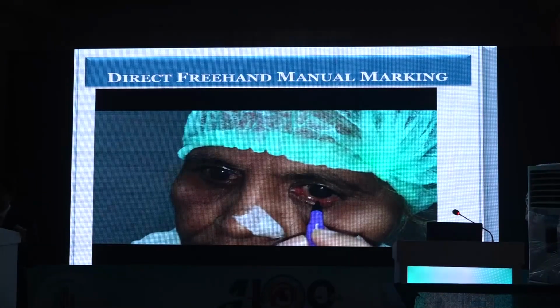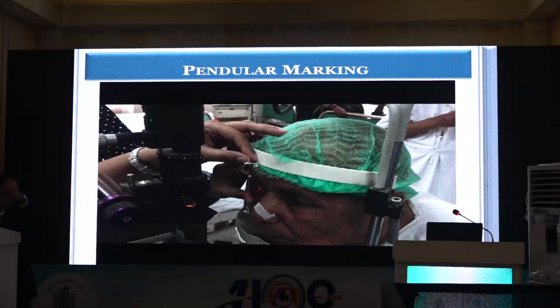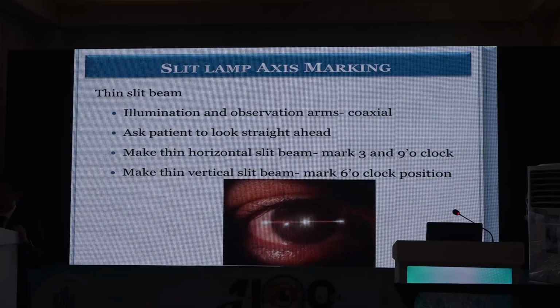Another method is that you can directly mark. You ask the patient to look straight ahead, take a marker and mark the 6 o'clock position directly. Then people have also used pendulum marking, or there are various other methods.